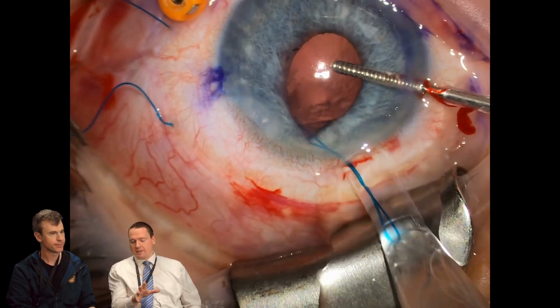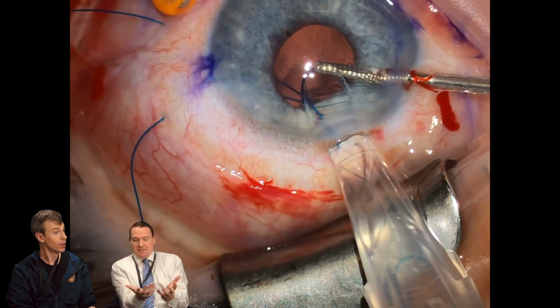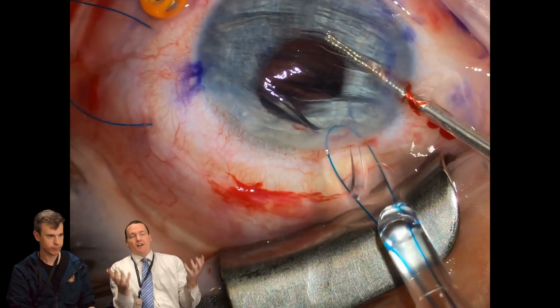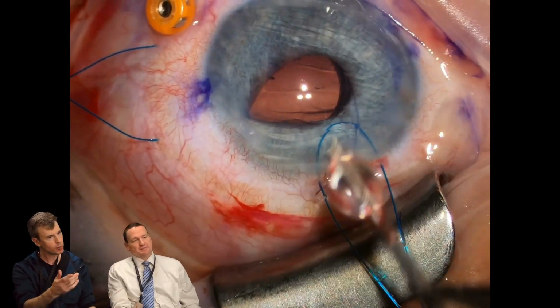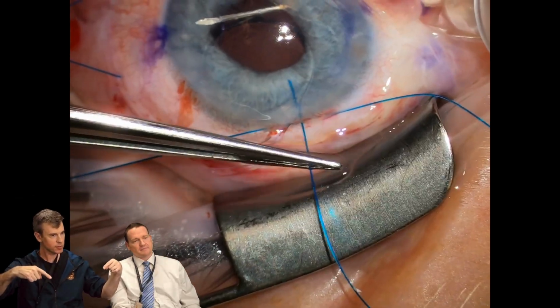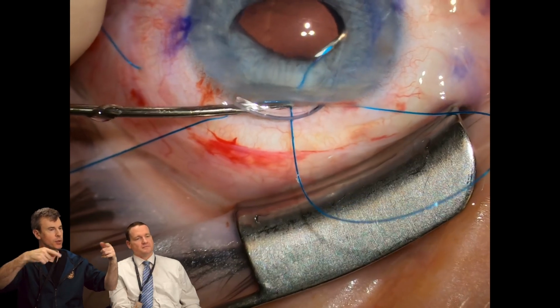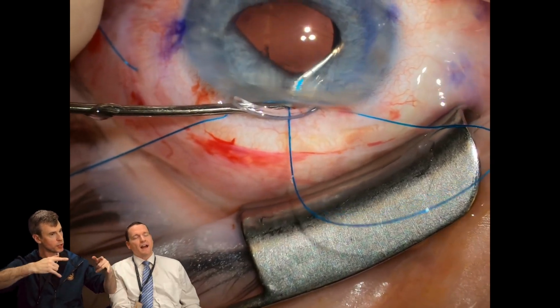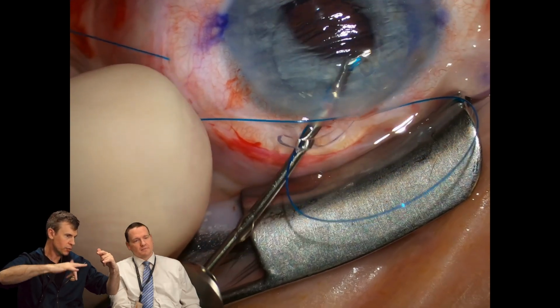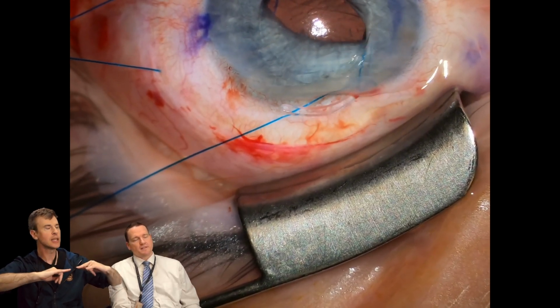Maybe this is an overly simplistic analogy, but I think of creating almost like a hammock behind the iris, and you're getting two Prolene going through one side, two Prolene through the other side, and it's going to hold that in place. Correct. And here the torque is important, so the two loops pass, and they have an orientation, right? Because the loop, if it goes front to back, is perfect. But if it goes side to side, it can induce some torque. So they should be exactly counter torque. So one rotates to the right, the other one rotates to the left. Thus, they even each other out and keep it flat.